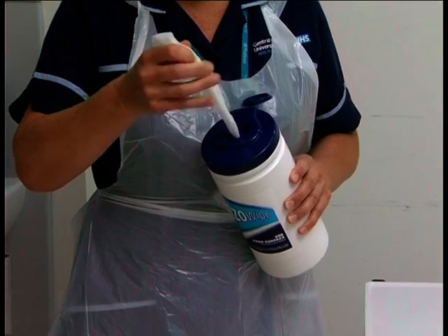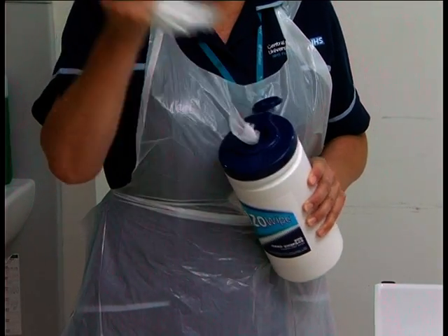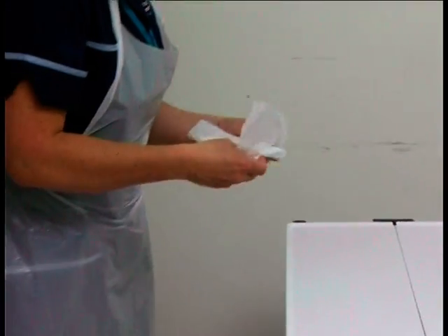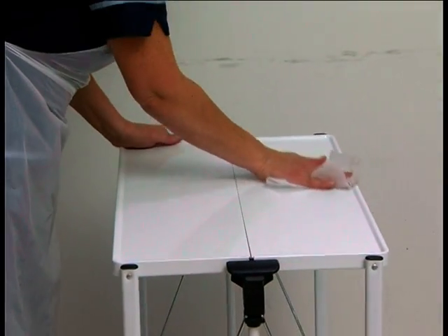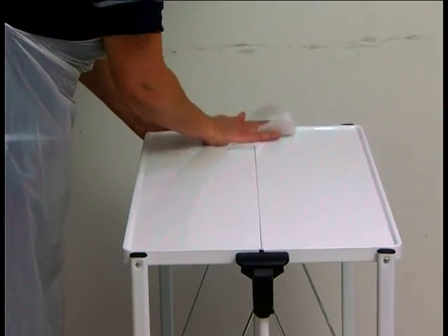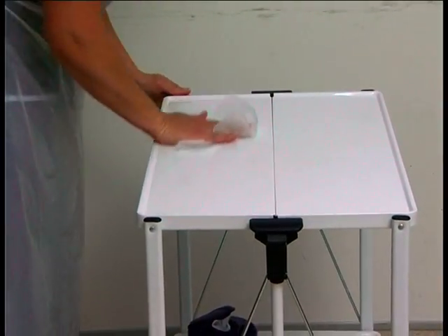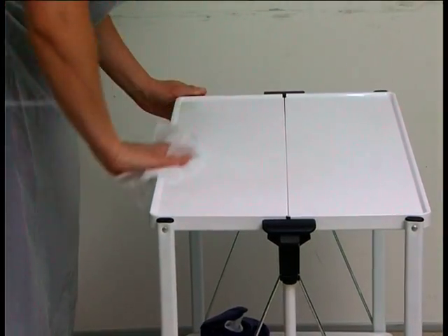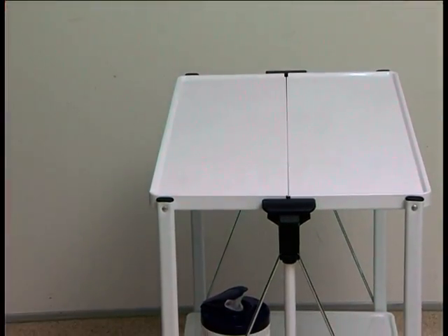Clean the top surface of your trolley with a 70% alcohol wipe, using a side-to-side motion and covering the entire surface area. The alcohol must be allowed to air dry for at least 30 seconds, longer if it still looks wet. Alcohol must always be allowed to dry for it to kill germs, viruses and other infective organisms.